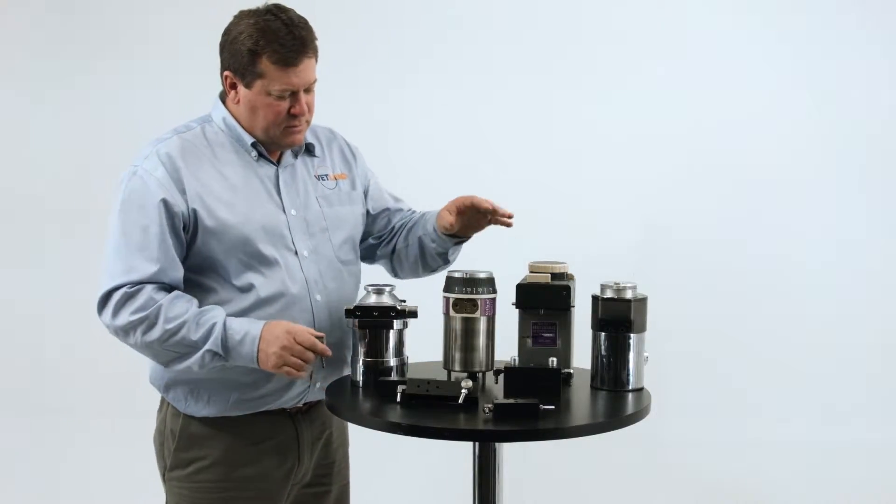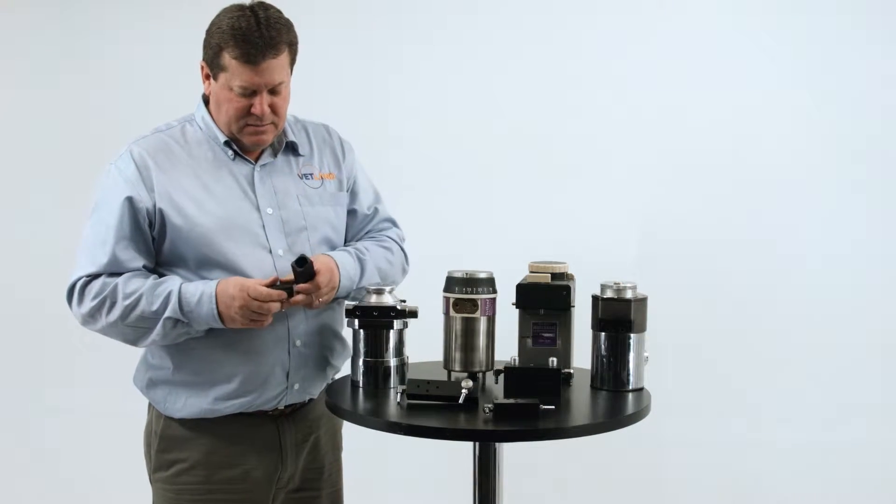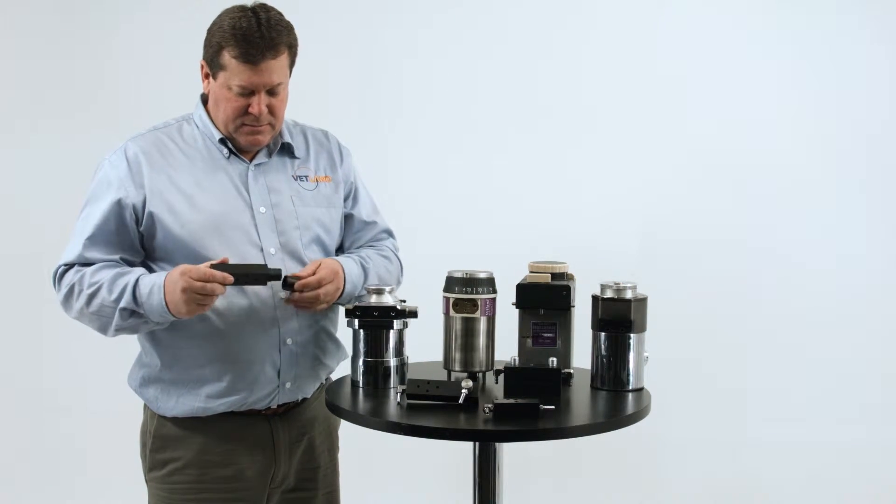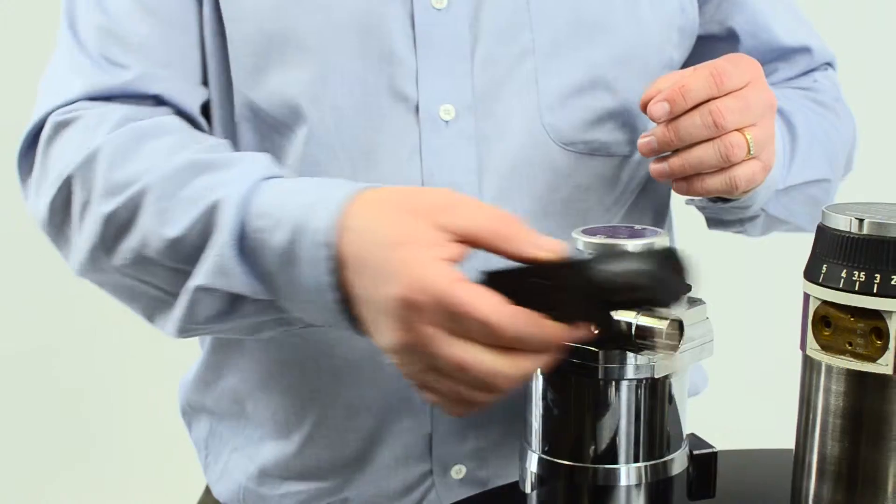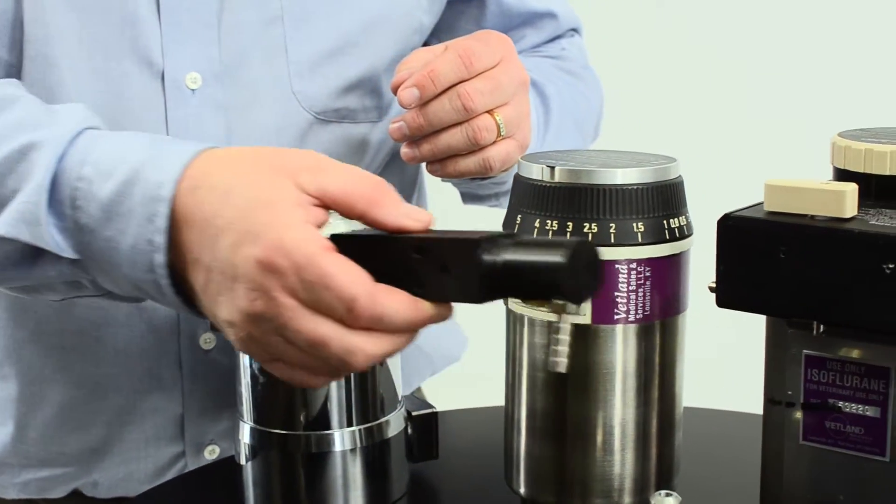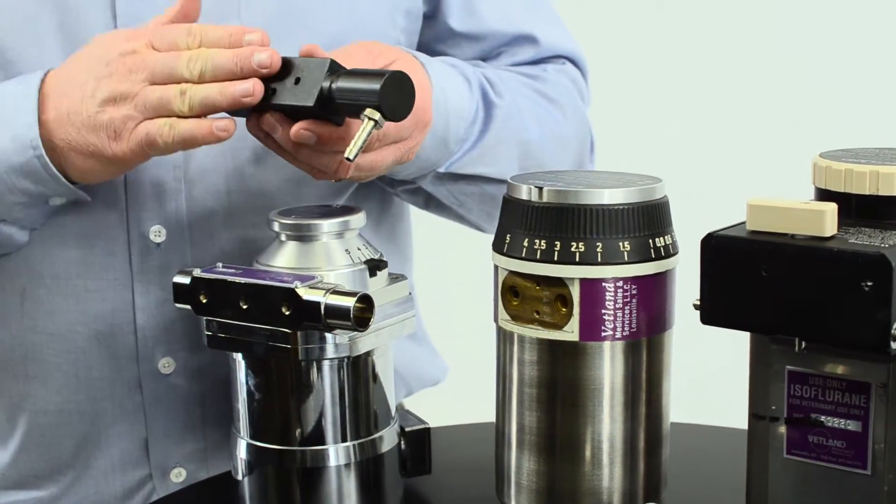The Draeger vaporizer, we can also have the same style manifold for it. It's a 23 millimeter slip fit that bolts on the back of the Draeger vaporizer. So that's one option.